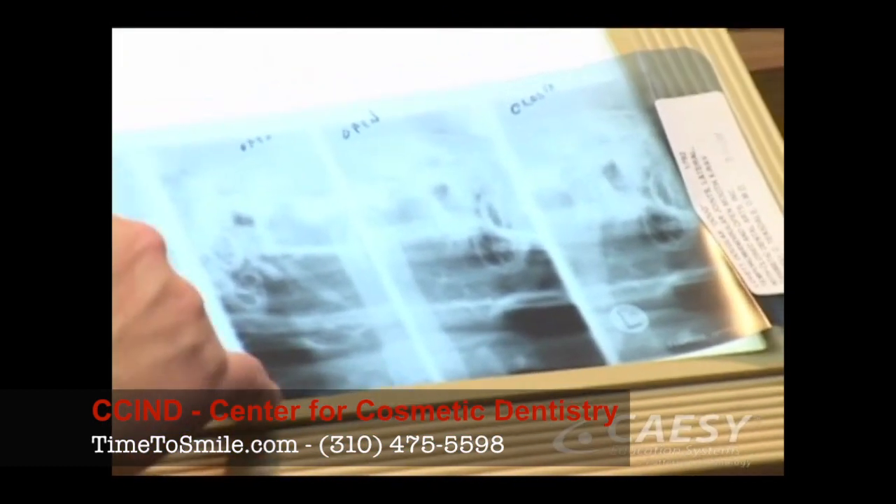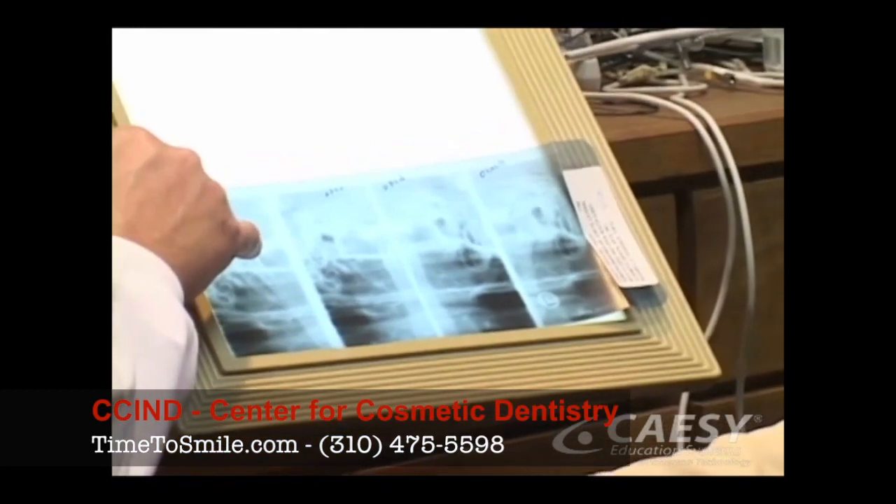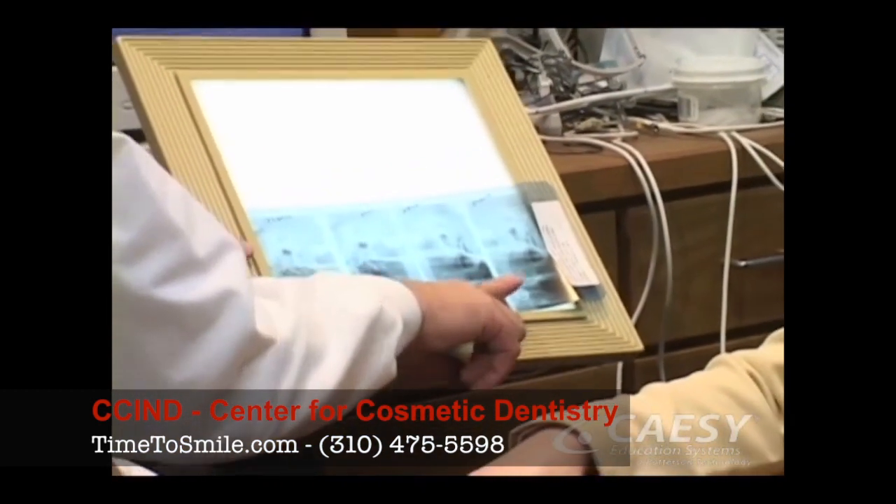Tomographs are specialized X-rays that give us a detailed view of the jaw joint. This allows us to check the health and position of the bones of your jaw joint.